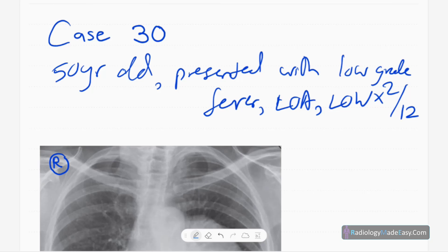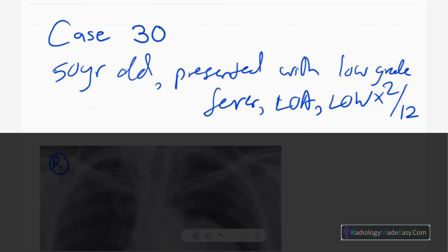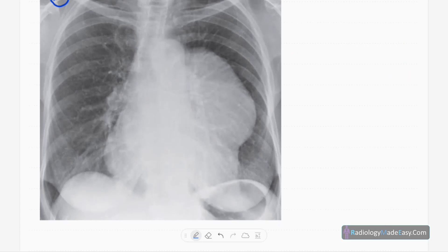Welcome back. This is case number 30 in the RS series in Radiology. Today our patient is a 50-year-old patient who presented with low-grade fever, loss of appetite, and loss of weight for two months duration. This is the frontal chest radiograph of a mature female patient — you can see the breast shadows, confirming it's a female patient.